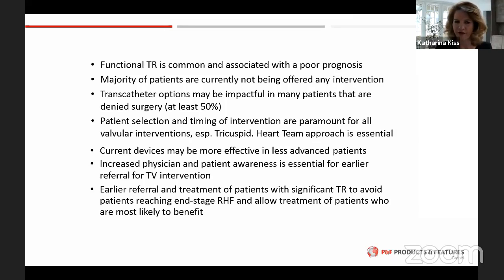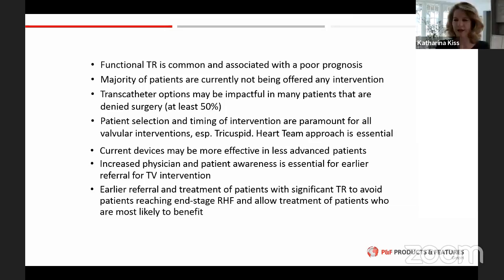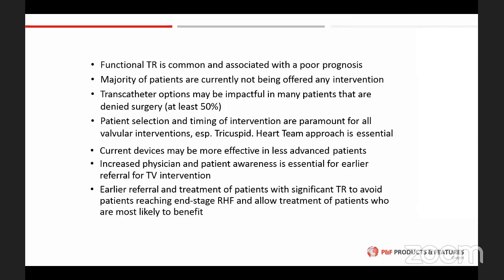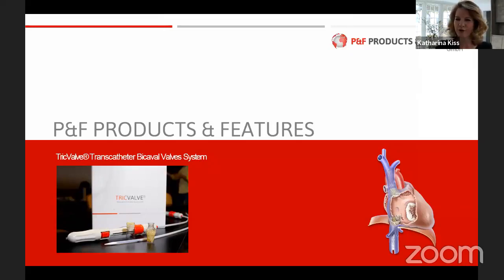essential for valvular interventions. Current devices may be more effective in less advanced patients, but I think this is a general thing. And of course, we have to increase patients' and physicians' awareness that this is essential for earlier referral for tricuspid valve intervention. The aim of earlier referral and treatment of patients with significant TR is to avoid patients reaching end-stage right heart failure and to allow the treatment of patients who are most likely to benefit. So this leads over to the topic of today.